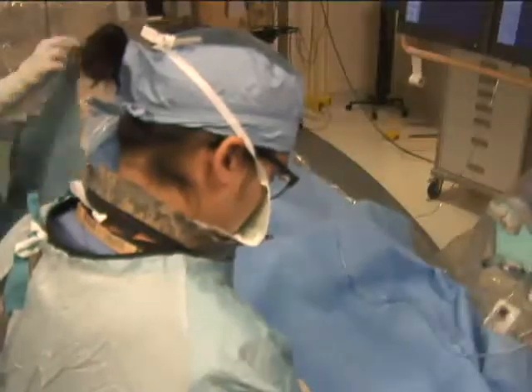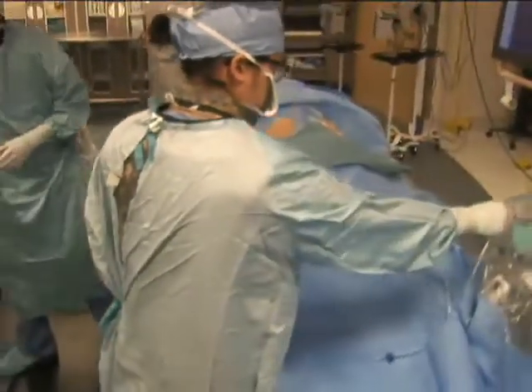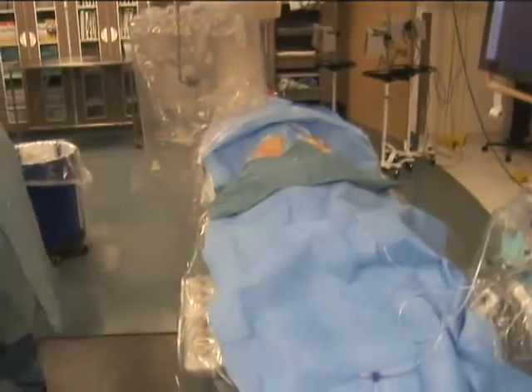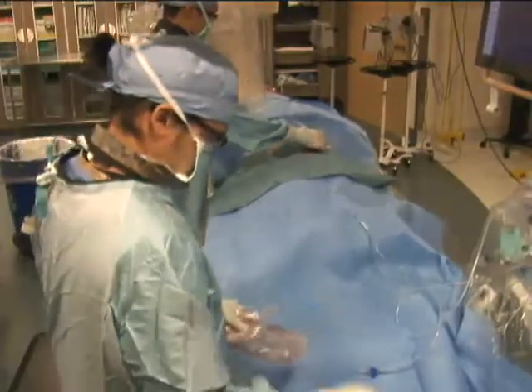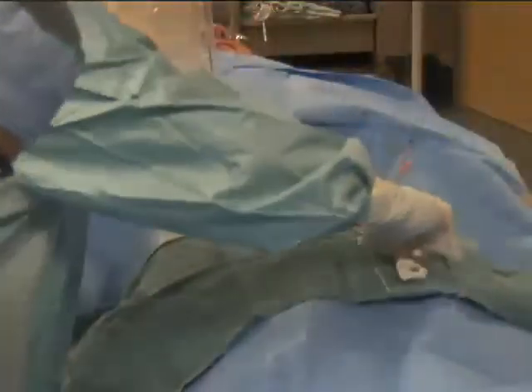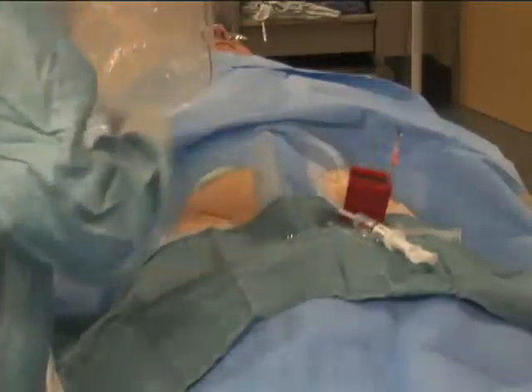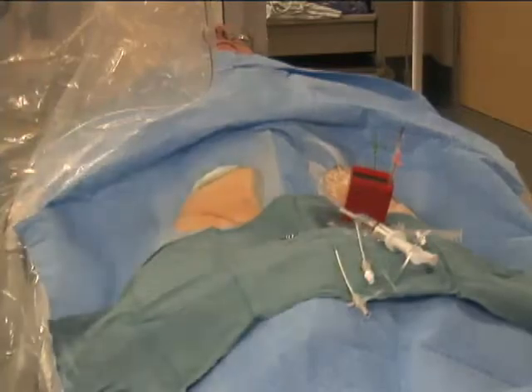In this example, the tubing for the contrast injection system also serves as the tubing for invasive hemodynamic monitoring. This setup is similar to that of a standard injection manifold. The contrast injection system is prepared by attaching all tubes to the power injector and flushing the system with both heparinized saline and IV contrast.